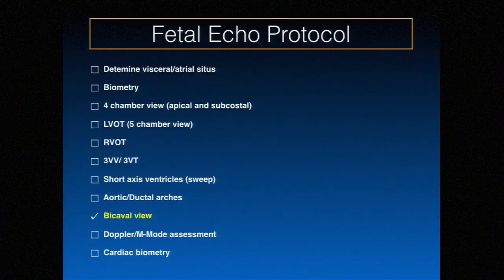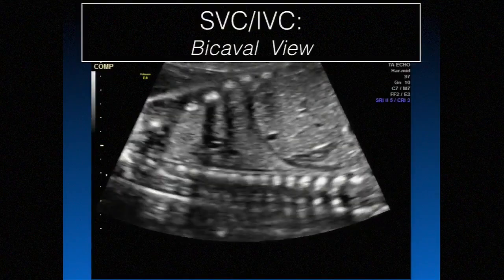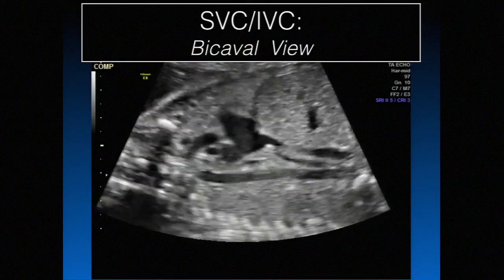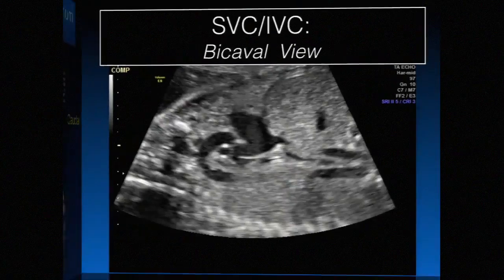And then moving into the bicaval view. So I think this is a nice sweep because it is very close to the level of your aortic arch as well, and we can actually appreciate a lot of anatomy from this view.